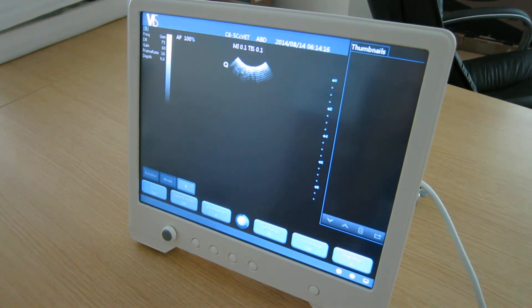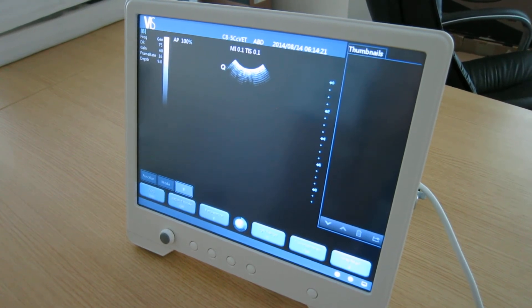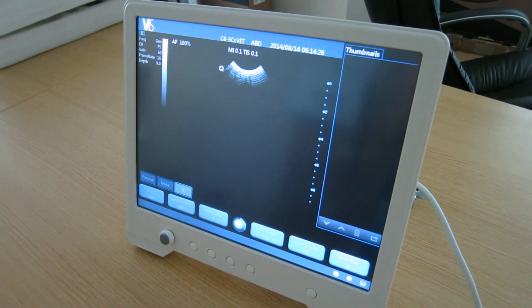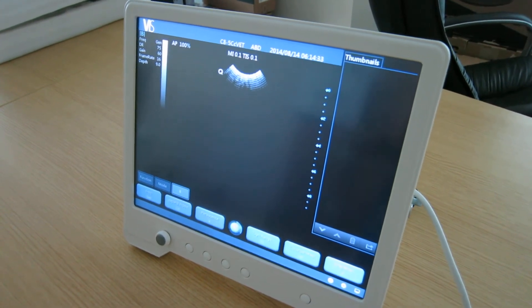Brief introduction to the VIS ScanPad, the fully touch screen ultrasound system — light and portable. Just a few simple tasks to be able to use the ScanPad.